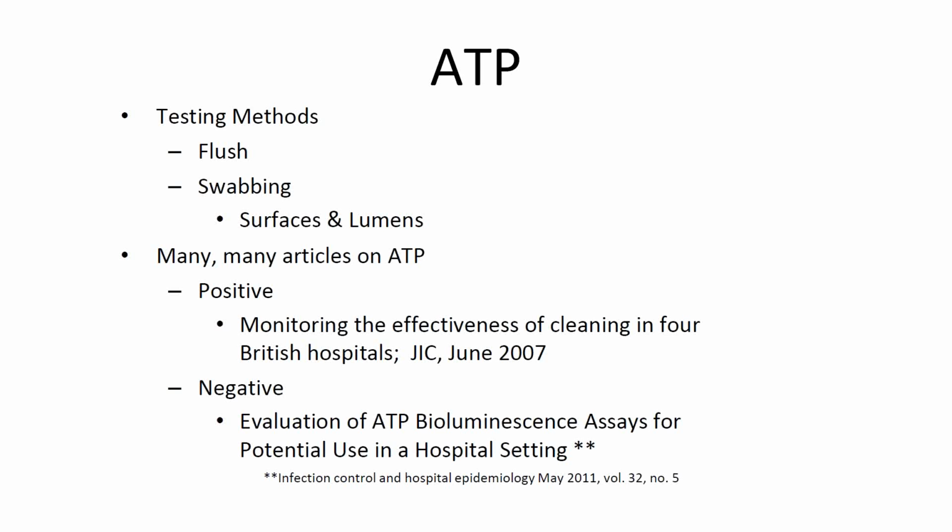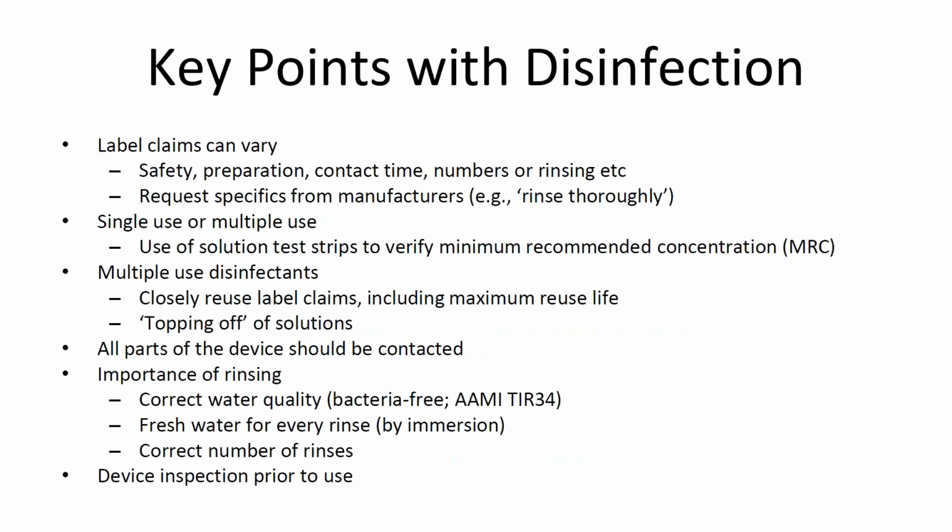Next slide, please. So now we've completed cleaning, we've completed our cleaning verification test. The scope moves on to either disinfection or sterilization. So we're going to look at disinfection because it is still the standard of care for flexible endoscopes. So let's look at some key points that are outlined in ST91 in regards to disinfection.